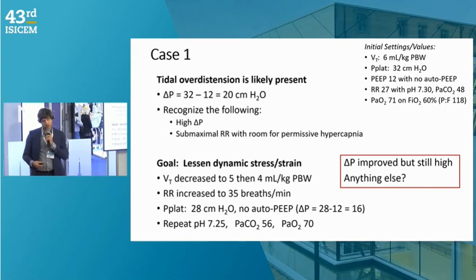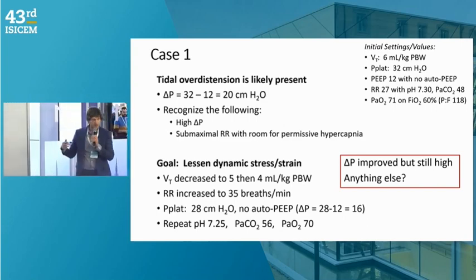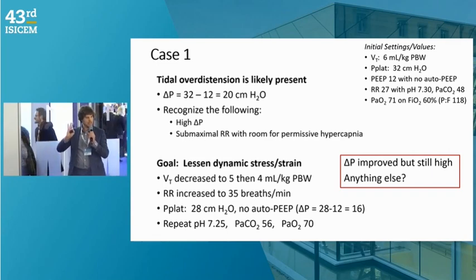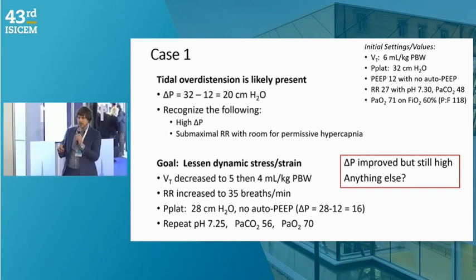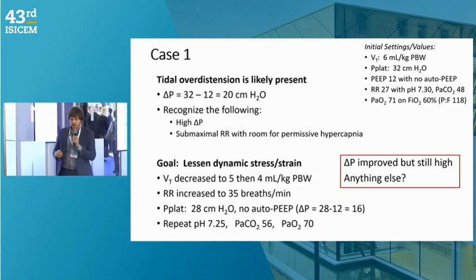That's a great question too. So Patricia's certainly right that both frequency and magnitude matter. But I think the data, both from clinical trials and from even ex vivo animal models, suggest between the two, it's the magnitude that is more injurious. And so in this case, yes, we went up a little bit on the respiratory rate. But the sort of ratio that's out there is 1 cc per kilo per 4 breaths per minute, which people suggest might be a magical number from cohort studies.